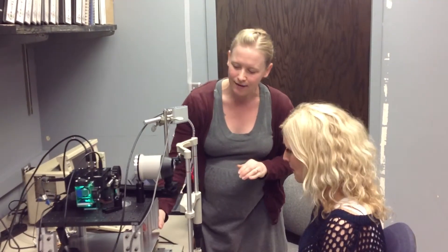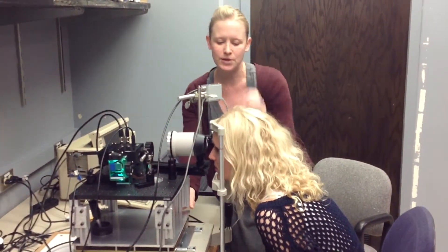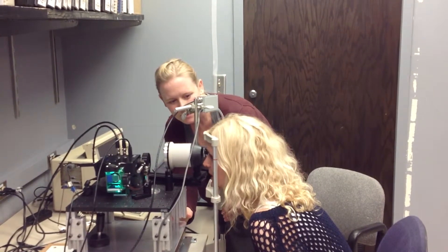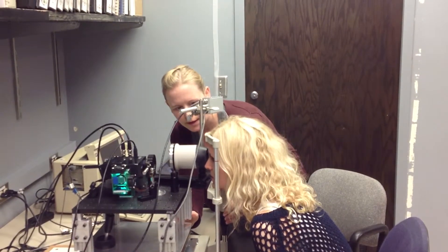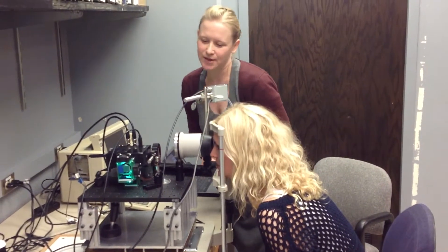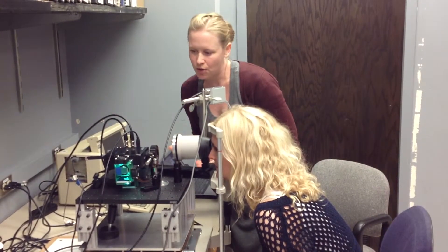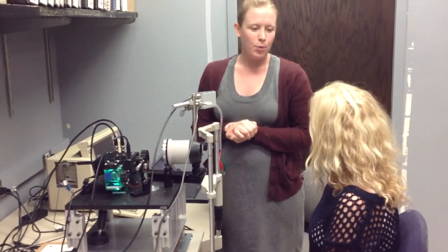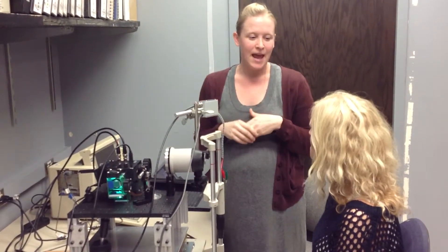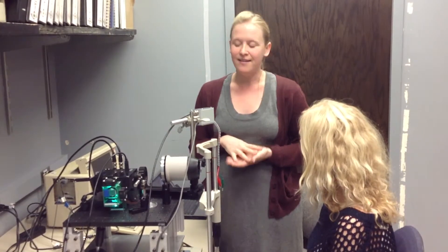We'll get you lined up in the machine — go ahead and put your chin on that little chin bar and rest your forehead up against here. Once we have the electrode on you, all you need to do is relax. Before each trial we'll count down to three, and at that point we want you to hold still and keep your eye open while we flash some different colored lights, then we'll let you know when it's time to stop. It should only take about eight or ten flashes, then you can take a break, close your eye, and we'll do the next light.